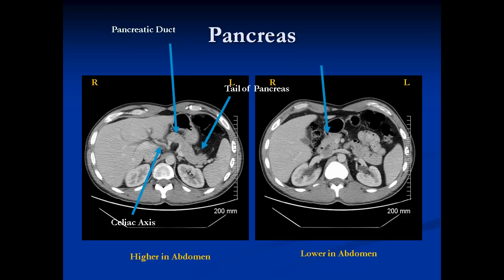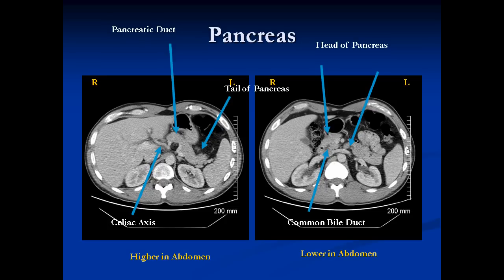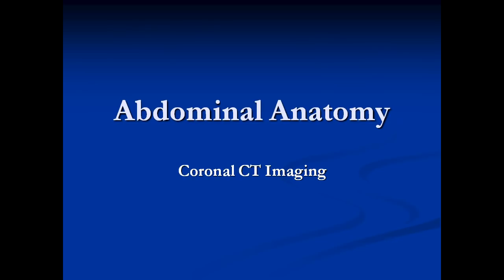Going to the next image, which is lower down, we see the head of the pancreas. In the middle of the head, we see this little black structure — the common bile duct, which comes down through the head of the pancreas to empty into the duodenum. The duodenum sits right next to the head of the pancreas on the right side. This vascular structure going across the aorta is the left renal vein, which almost always passes in front of the aorta, though in some individuals it goes behind.